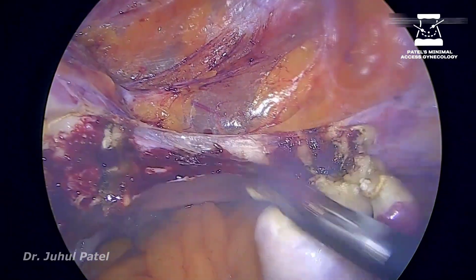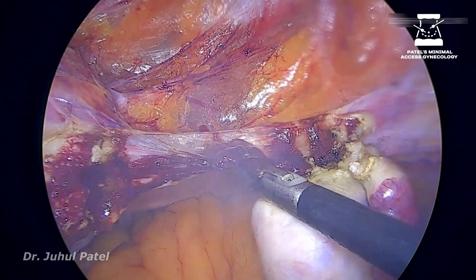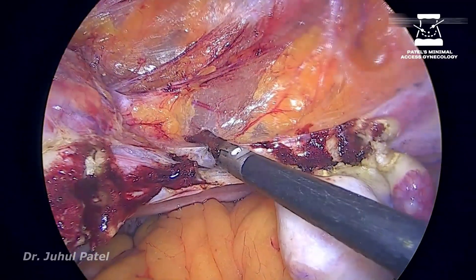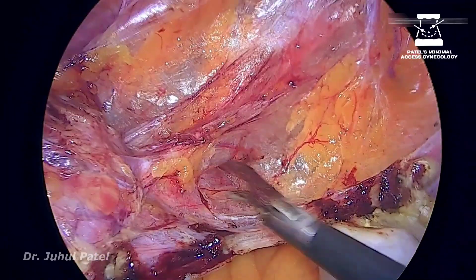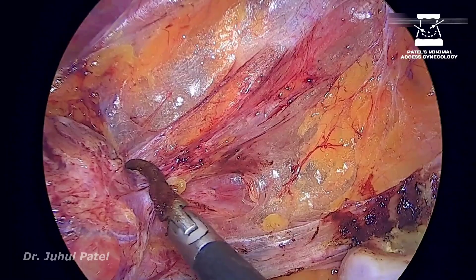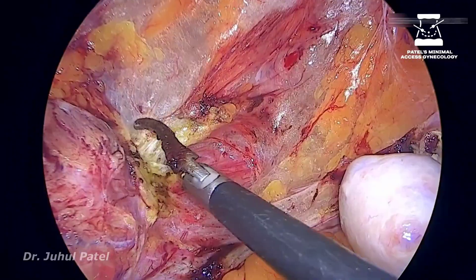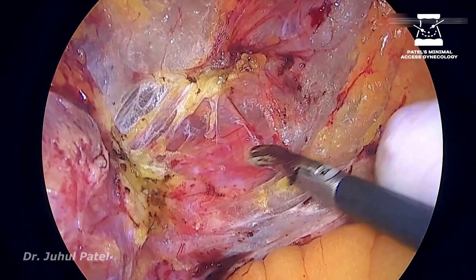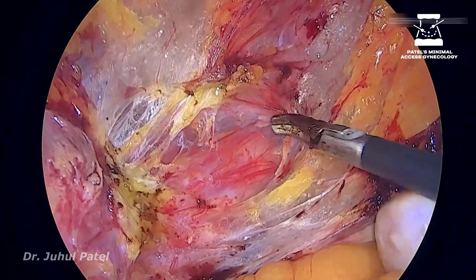I will be cutting both leaves of the broad ligament together until I reach the muscle. Now I am in the vesicovaginal space. Once I have dissected into the vesicovaginal space, the bladder is well down. I will come to the site of adhesion where the bladder has adhered to the previous section site, and I keep on chopping the adhesions, sending the bladder down.